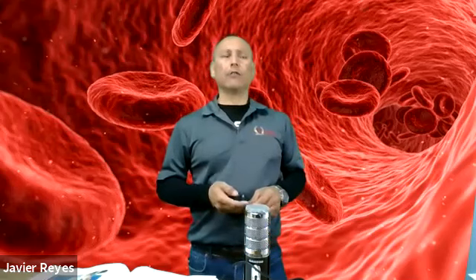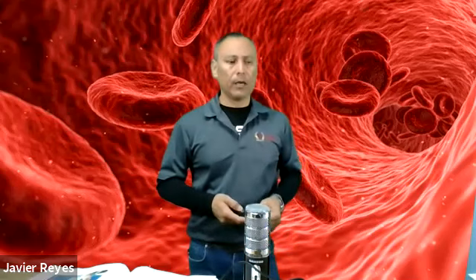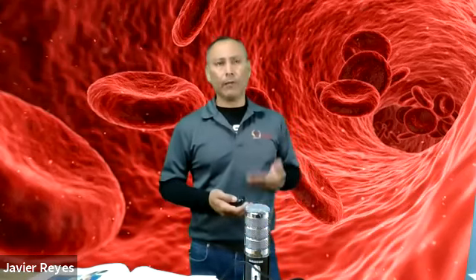What are the indications for capillary puncture? When do we need to collect a capillary puncture in adults or older children? When the veins that are available are very fragile or must be saved for other procedures. Perhaps the patient requires some kind of a surgical procedure on their arms, and the physician has ordered no venipuncture on that specific arm.